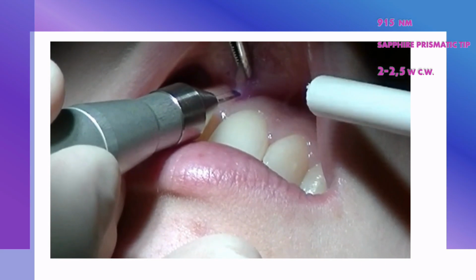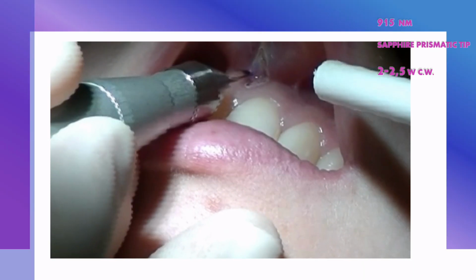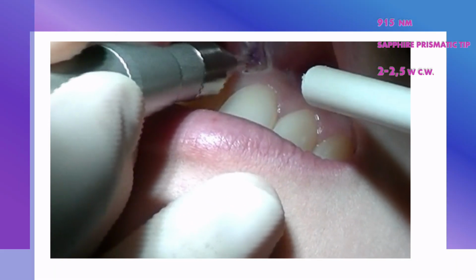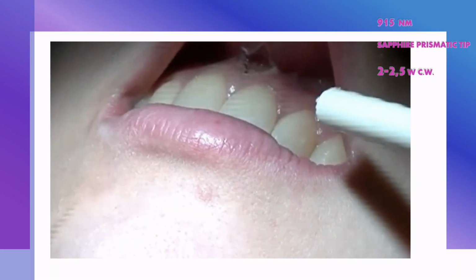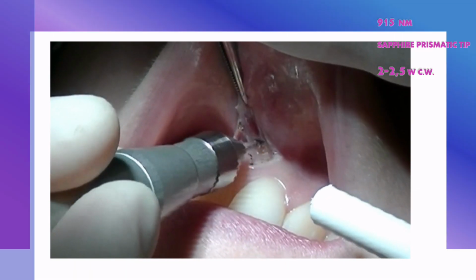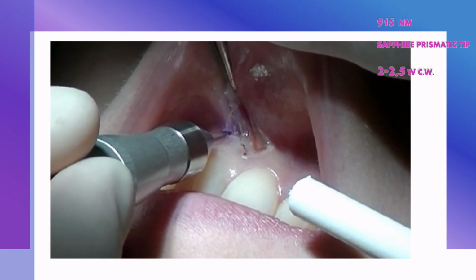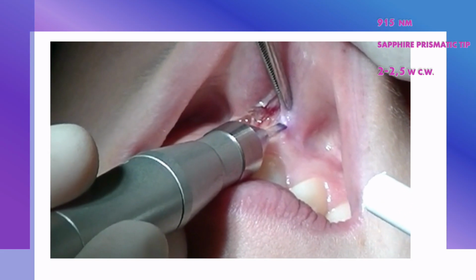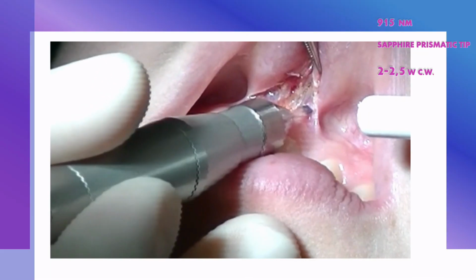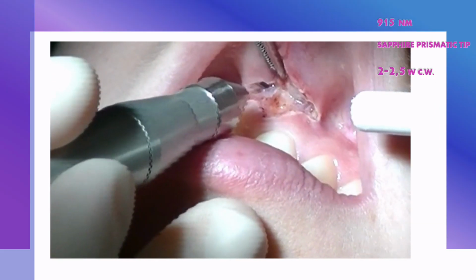The tip is properly activated and started with a bluish paper before the procedure to increase its efficiency. The incision is performed enhancing the visibility of all the surgical area and increasing the control of tissue anatomical planes operated by the surgeon. The whole procedure can be performed without pain referred by the patient, with moderate or no bleeding, and in this case, with no suture. Clinical setting of power used in this case was 2 Watt in continuous mode emission.